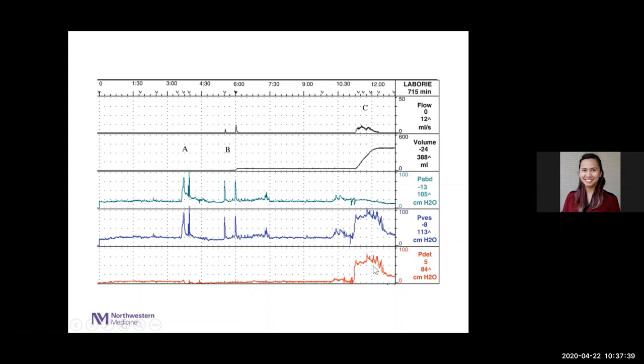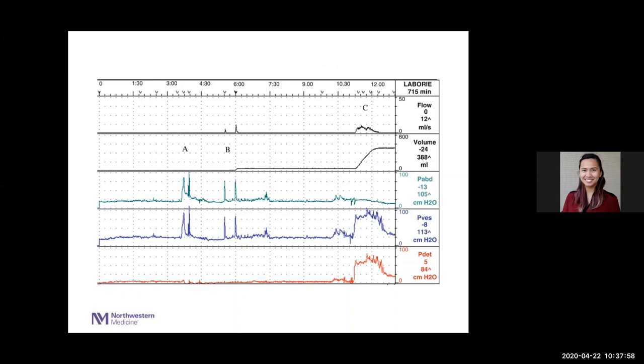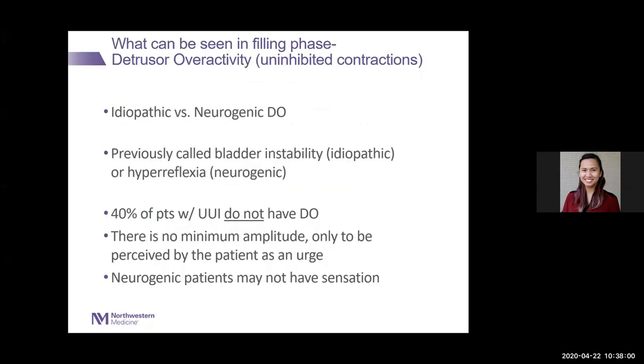So this may be, depending on what the situation is, a fairly unobstructed normal study. You might say this is a little high, but it actually looks not terrible, maybe 80. So it's a little on the high side with these spikes, but sometimes you get these artifacts in here that make it a little hard to see. So this is probably a stress incontinence patient with a fairly normal flow. It could be a man post-prostatectomy or something. Of course, that never happens.